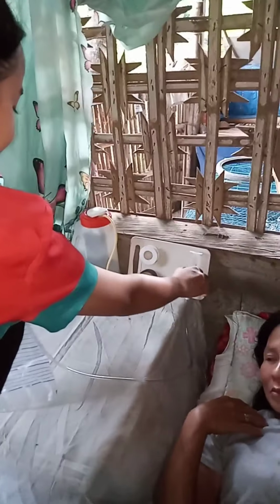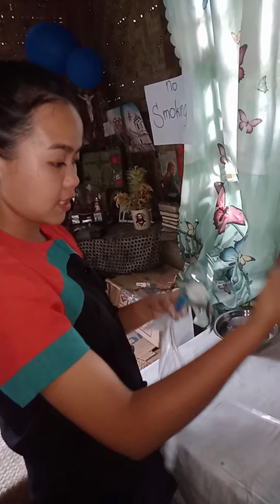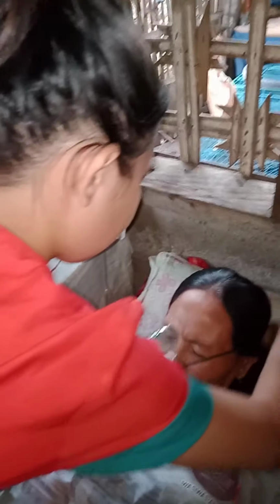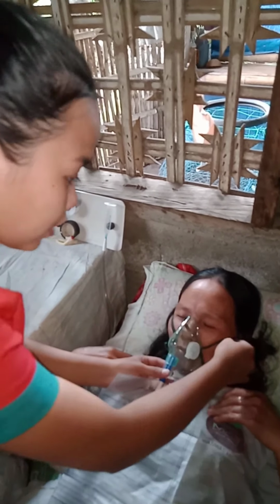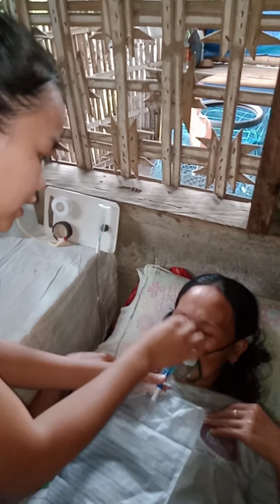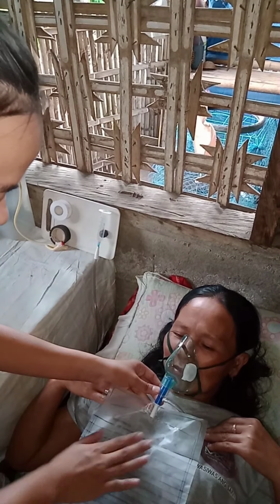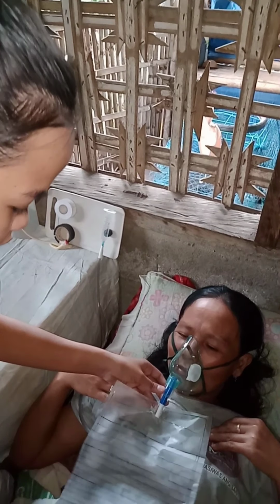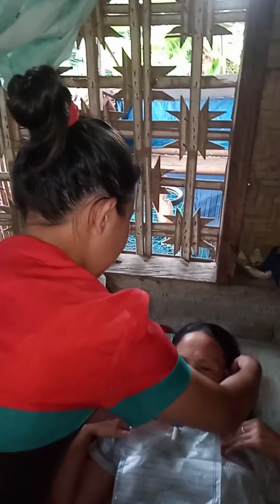Then turn on the prescribed flow rate. Then it is time to attach this to the patient's face. Again, secure this over the patient's ears. Then slightly pinch the nose to secure a good seal. Then just position this in a comfortable position. Then it is time to get this.